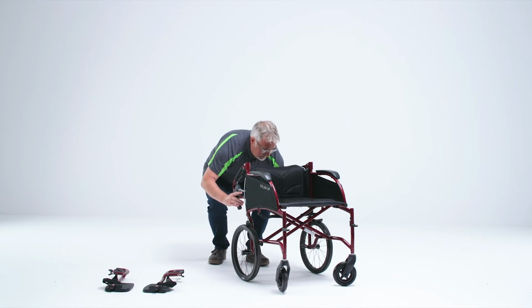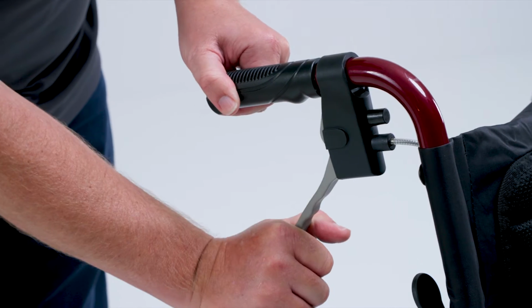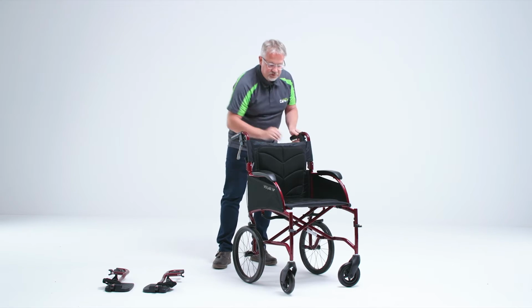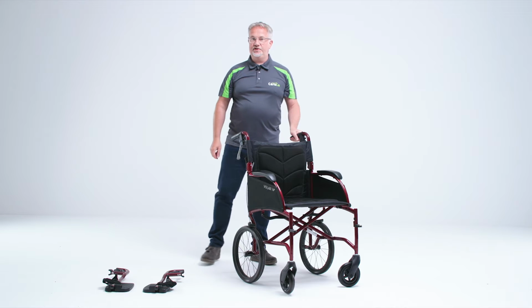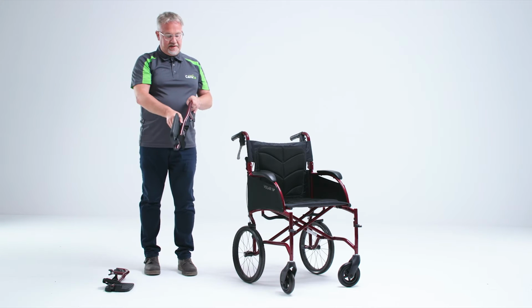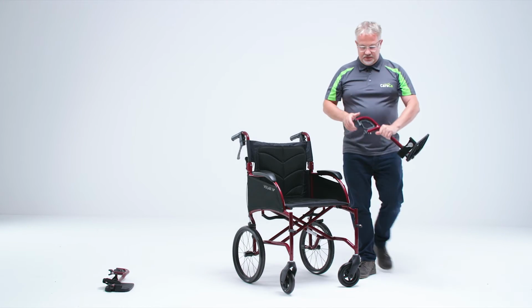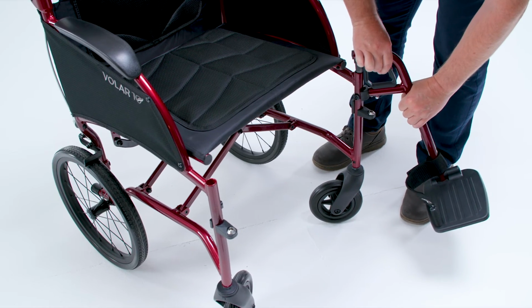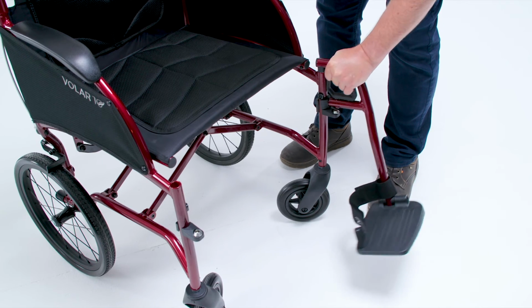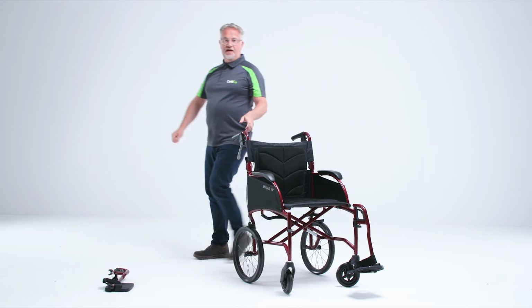Then simply lift the handles at the back for the backrest and then apply the brakes, which will help for you to fit the footrests into position. Starting with the left footrest, we can open that out and simply place in position, and it should just click in. Same with the right hand footrest.